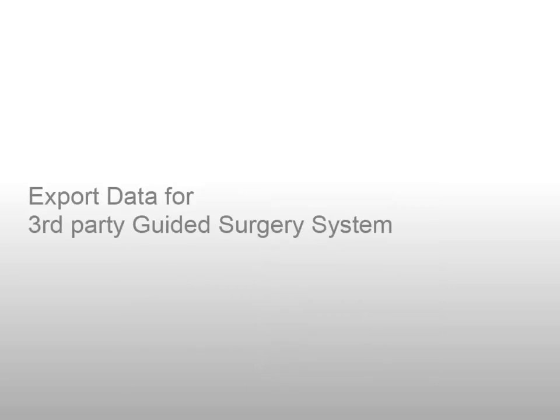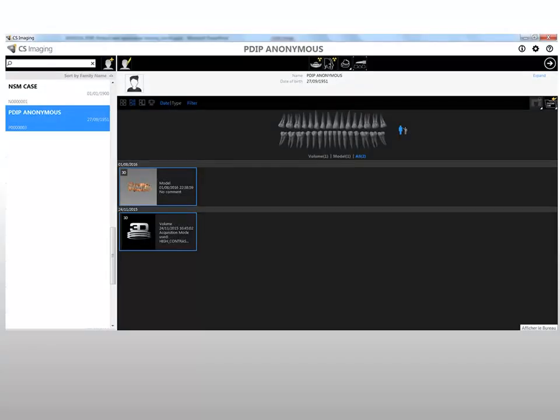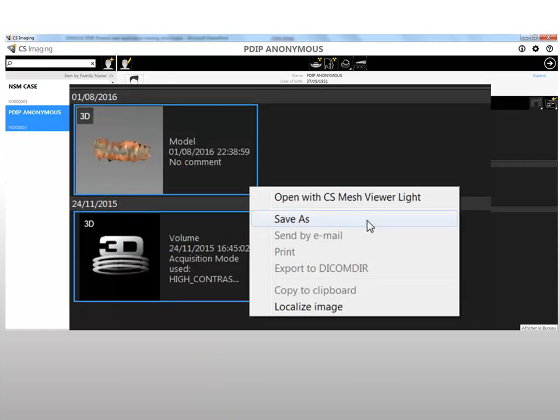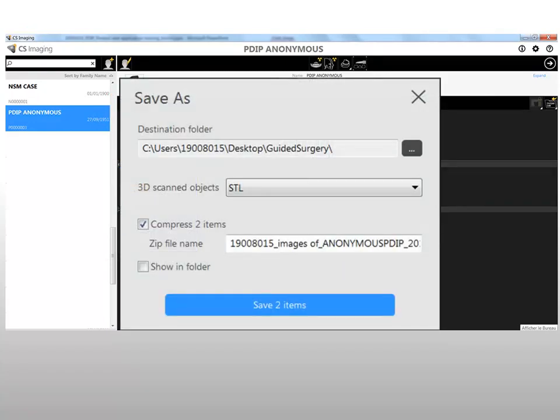To export data for a third-party guided surgery system, in the CS Imaging patient browser, select the 3D volume and the 3D model to export. Right-click and select Save As. Select the folder and location to export data, select the format of the 3D model, and select Compress Two Items to store data as a zip file archive. Click Save. The data is exported to the folder and location specified.